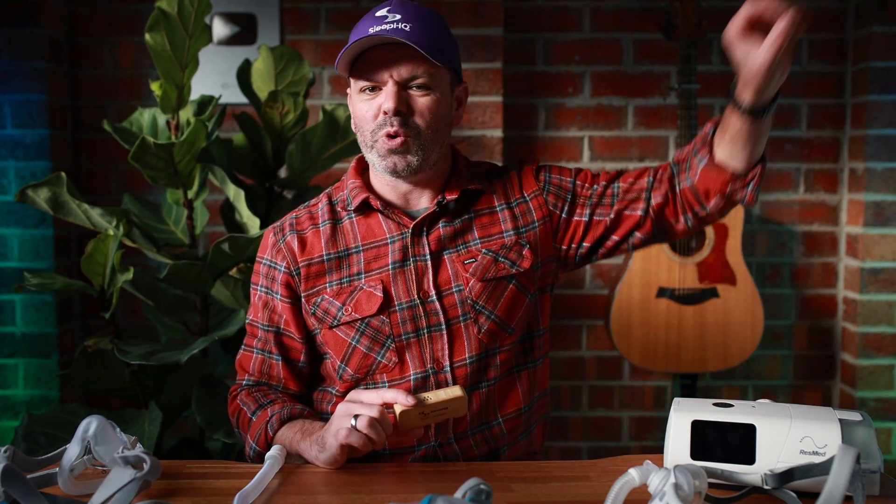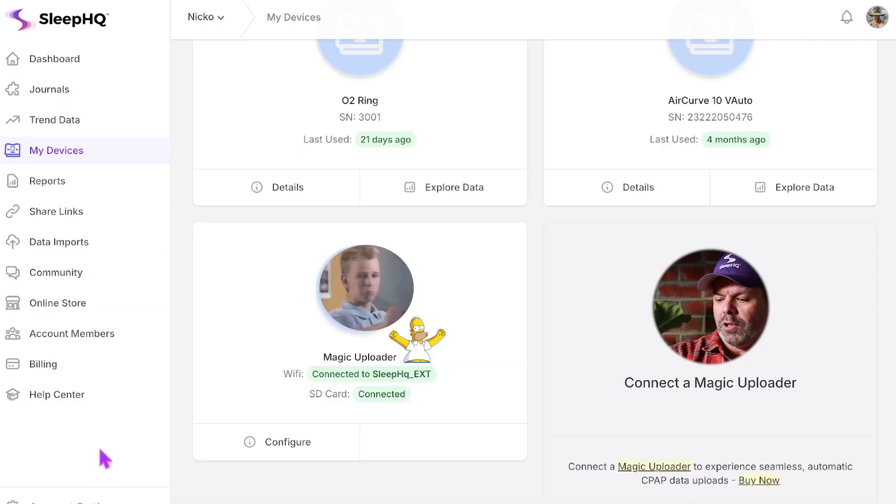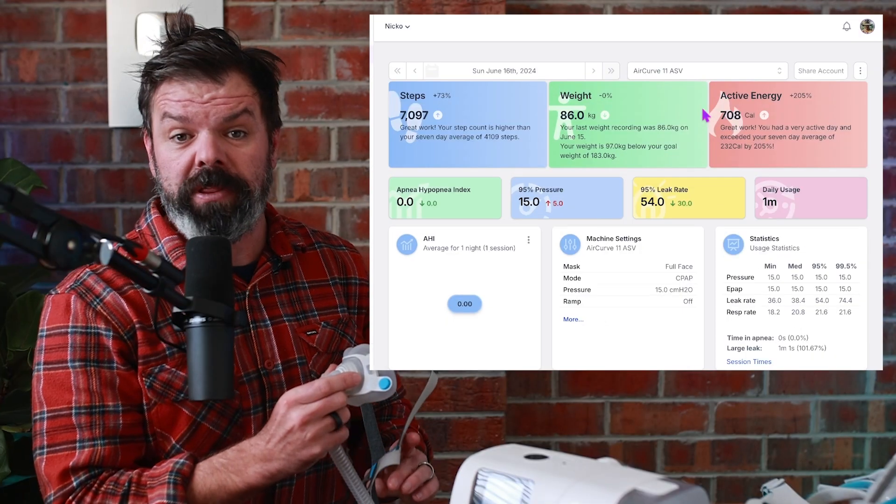Now we're using the Magic Uploader — this is data in real time. It connects my CPAP up to my home Wi-Fi and sends all that data straight up to Sleep HQ. We can see it right here: Magic Uploader connected to Sleep HQ, it's connected via the Wi-Fi SD card. We'll start with the F40.